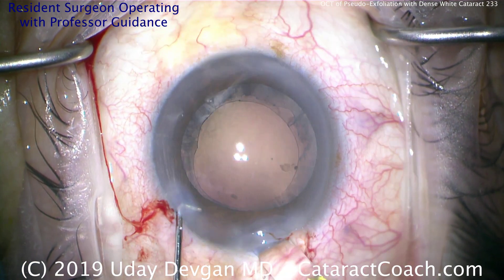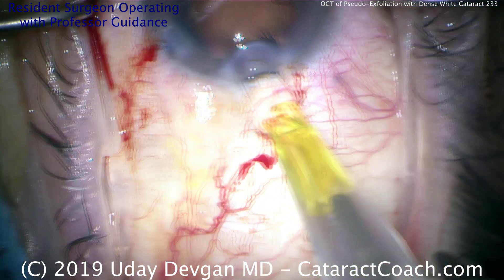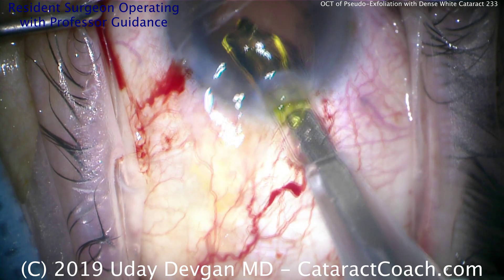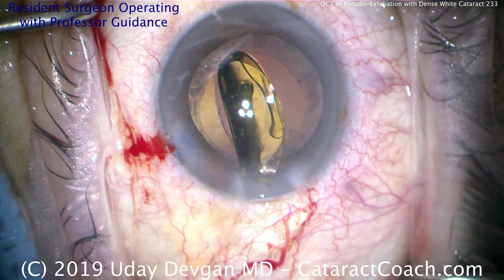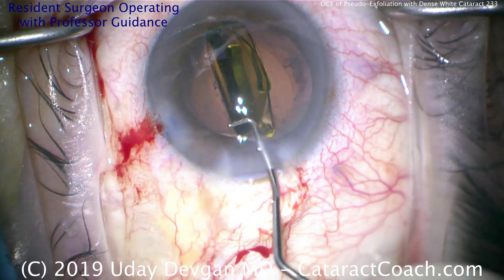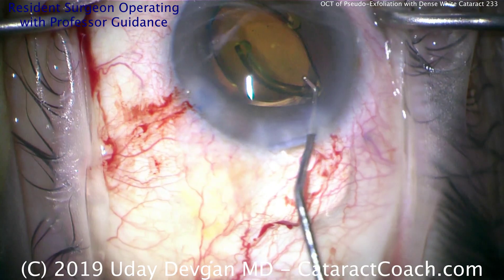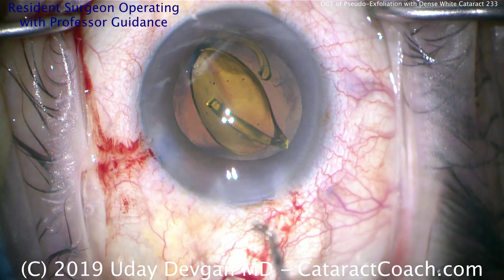Now it's time to deliver the lens — and we've got a surprise here. Watch carefully. Here comes the lens, a single-piece acrylic lens. The eye is not in primary position — keep the eye in primary. Delivering the lens — wait a minute, it's on its side, it's flipping, going the wrong direction. Look at the haptics — right now they're in the S formation. That is incorrect. S is not what you want — S is the stupid mistake. Don't do that. So we need to flip this lens back over the other direction.